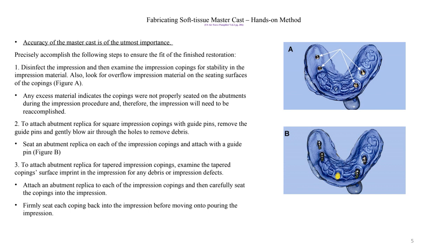Fabricating the master cast. Depending on the type of restoration or prosthesis, for fixed prosthesis we like to use a soft tissue material. The soft tissue material is a silicone-based material, and the purpose is to be able to remove the soft tissue from the master cast to see the fit of the abutment and the prosthesis during the fabrication process.